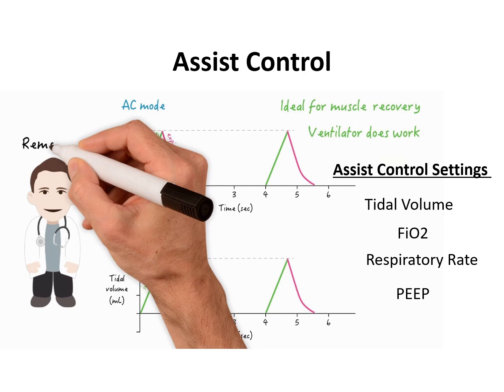The volume control mode shows a delivery of preset tidal volume with a preset respiratory rate, and expiration begins when the preset tidal volume is delivered, or if the high pressure limit is exceeded. So again, this is considered a full support mode.